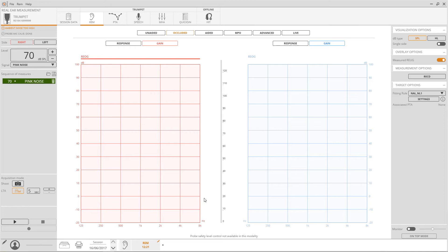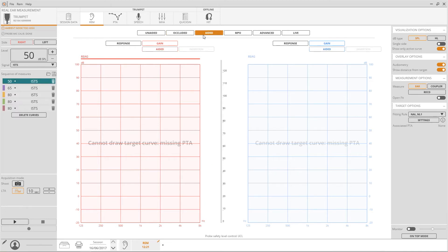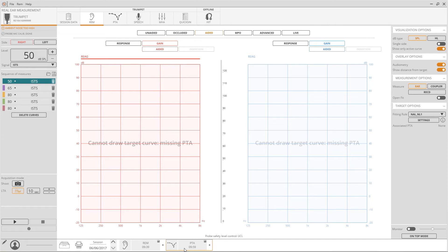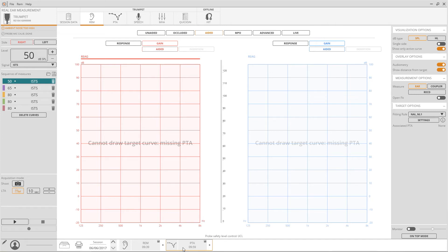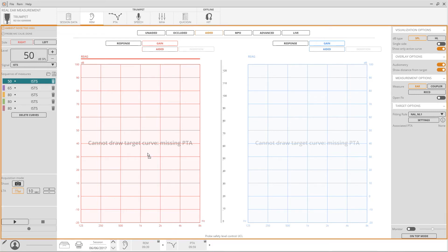Now move to aided and turn on the hearing aid. Before starting, the software requires the match of a pure tone audiometry. Drag it from the exam bar at the bottom of the page and drop it on the graph. The prescription curve will be displayed as a dashed line according to the stimulus intensity selected.